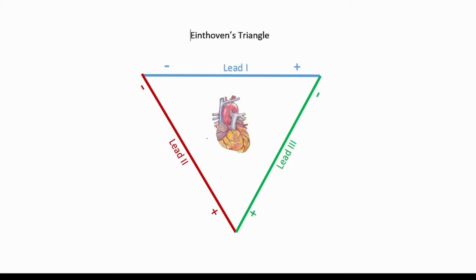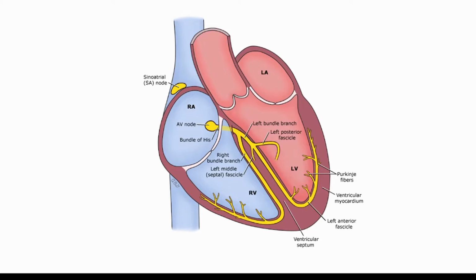So generally, the movement of impulses of the heart go in this particular direction, okay? And what do you see from lead 2? Well, lead 2, as we know, with all bipolar leads, we measure from the negative to the positive. And so lead 2, as you can see here, best matches the general movement of the impulses of the heart, okay? So that's why lead 2 is very important, and especially in terms of net vectors and understanding how they work. So now let's start getting accustomed to the idea of net vectors.